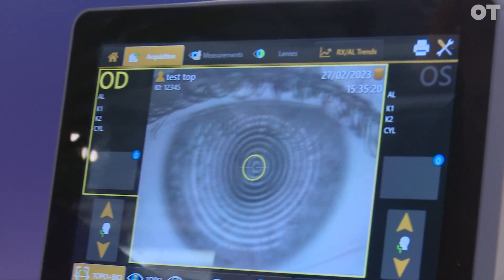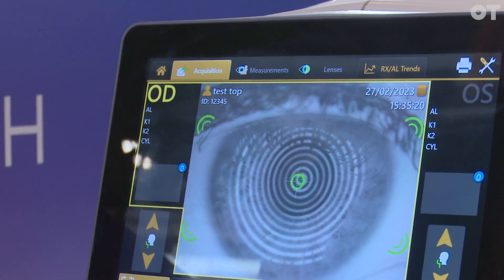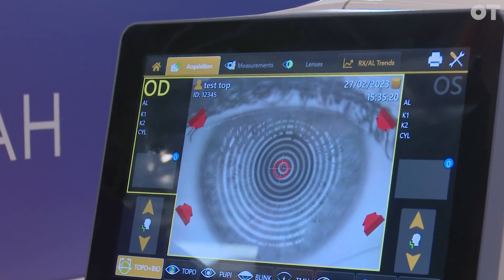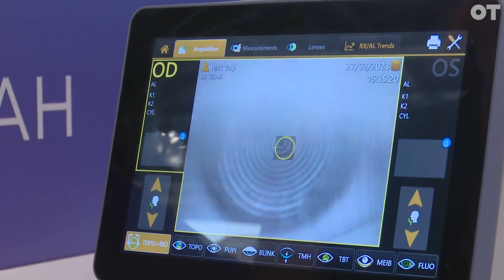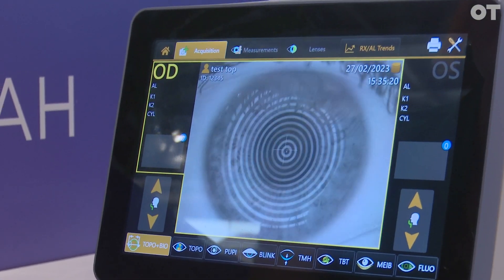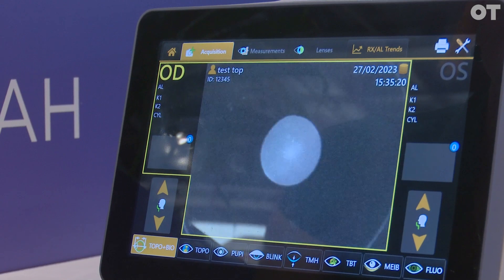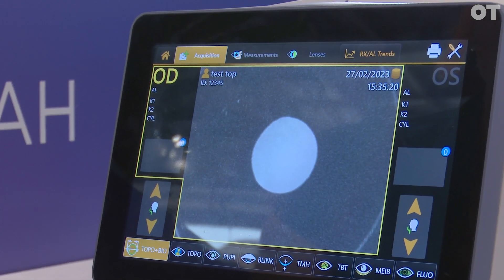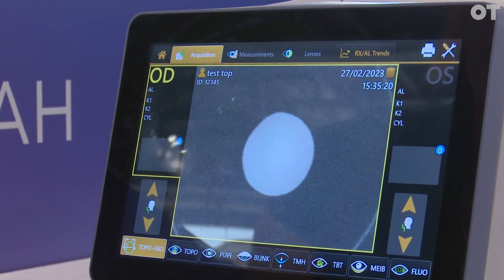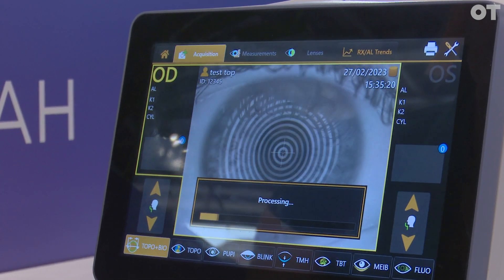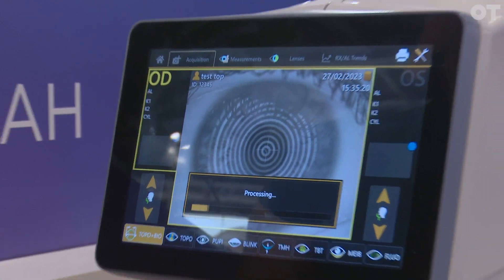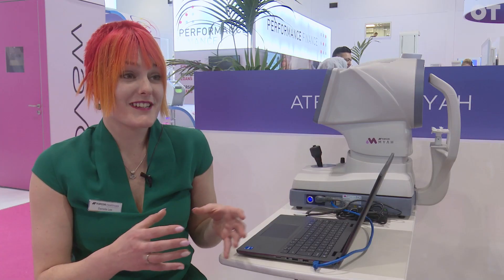It's a really quick capture. We adjust the guides and if you can have a really quick blink for me and eyes nice and wide — hold still there. Perfect, and that is that capture done.